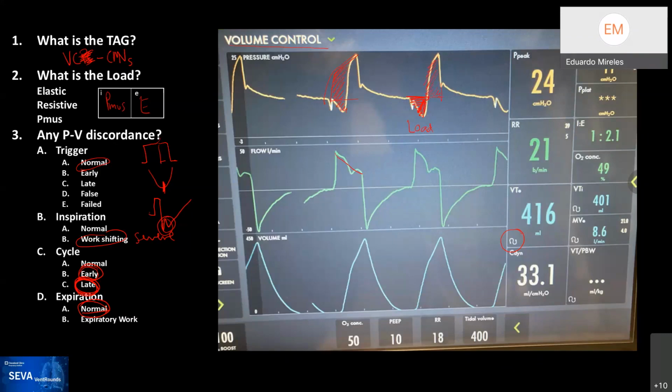Rob, Ariel, we have a comment. Yeah, we have a comment from Michael. He says a patient triggered breath followed by a subsequent patient effort would indicate an early cycle, or what sometimes is called reverse triggering. But I believe that we've defined an early trigger, wait a minute, an early cycle.